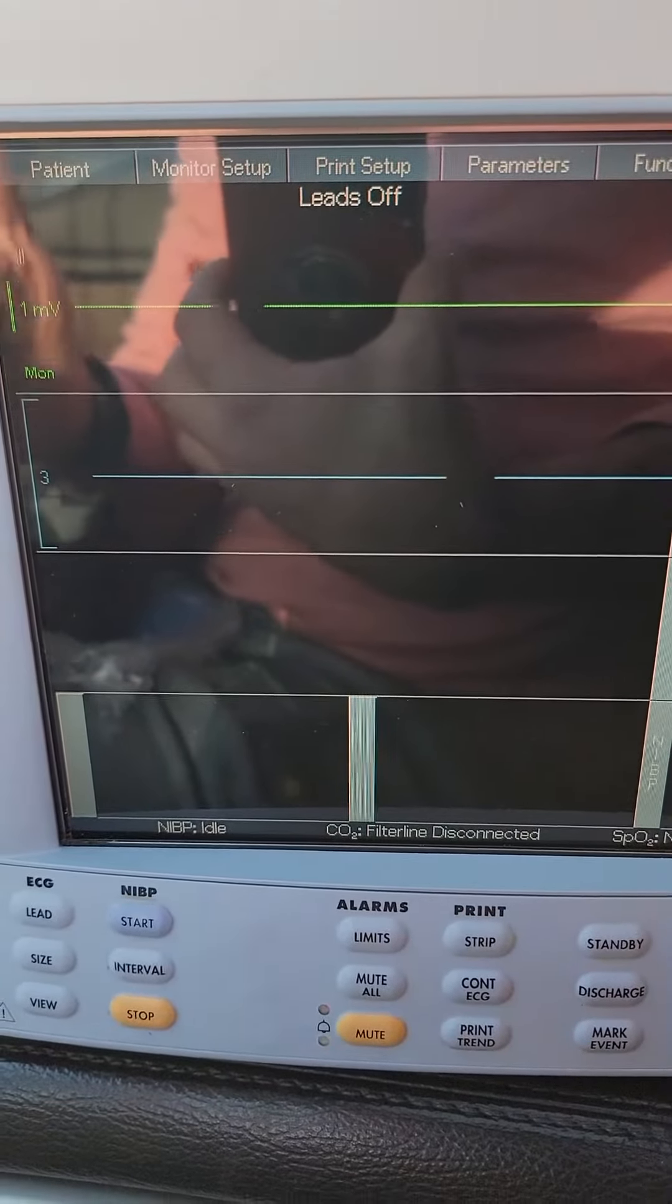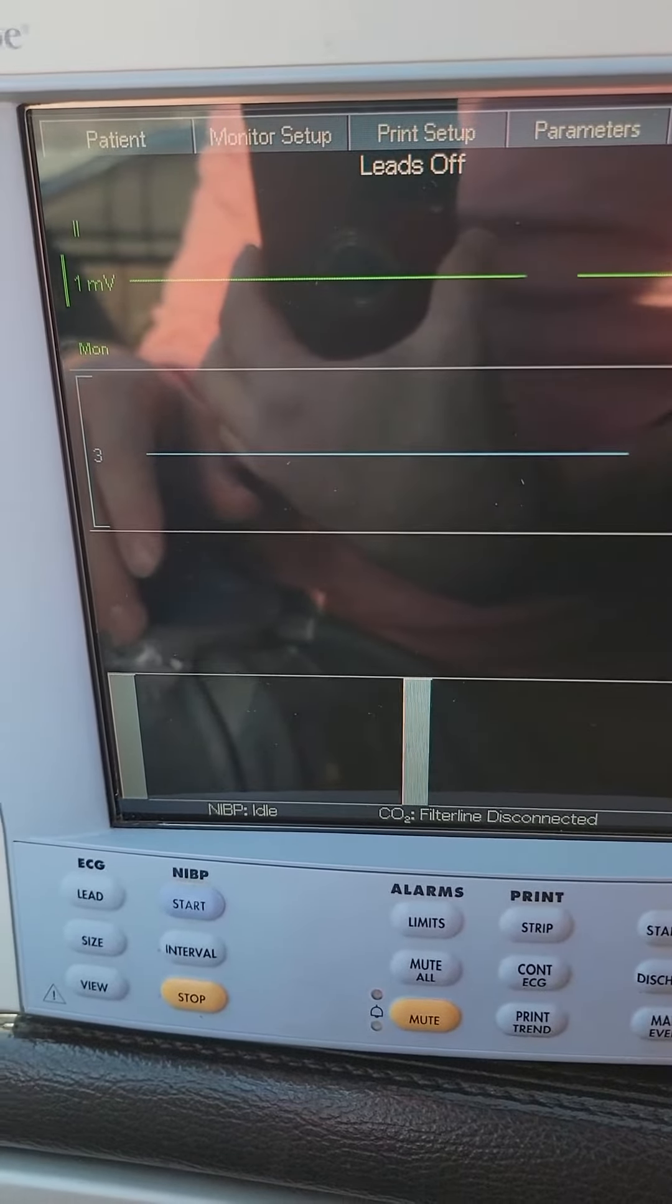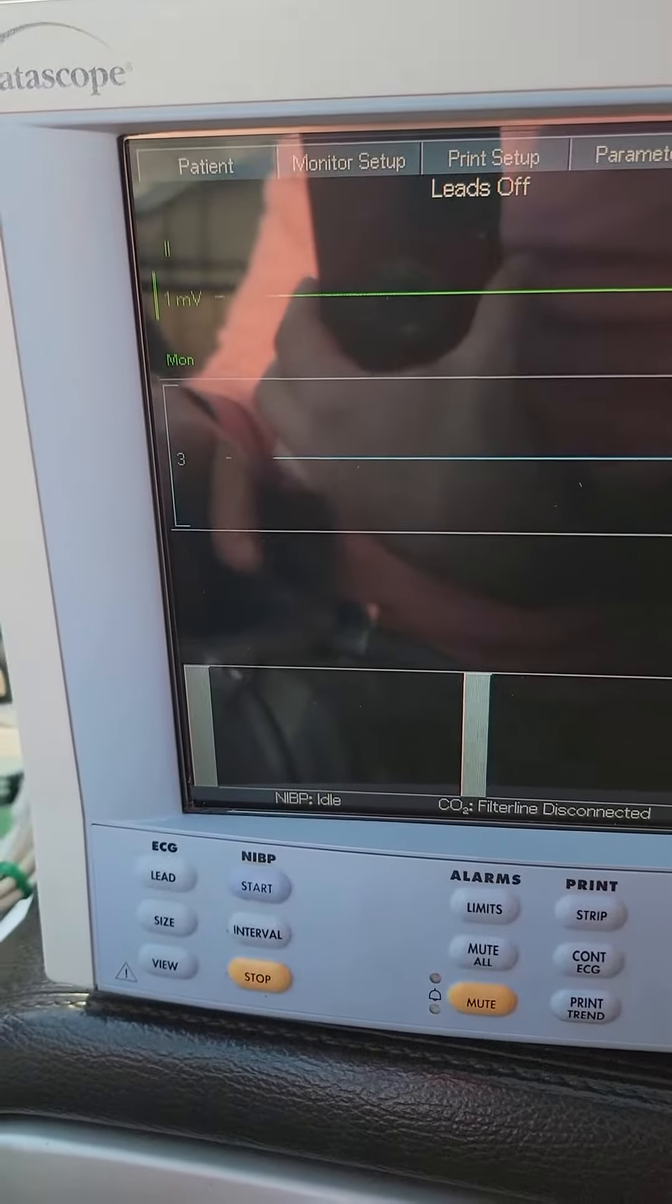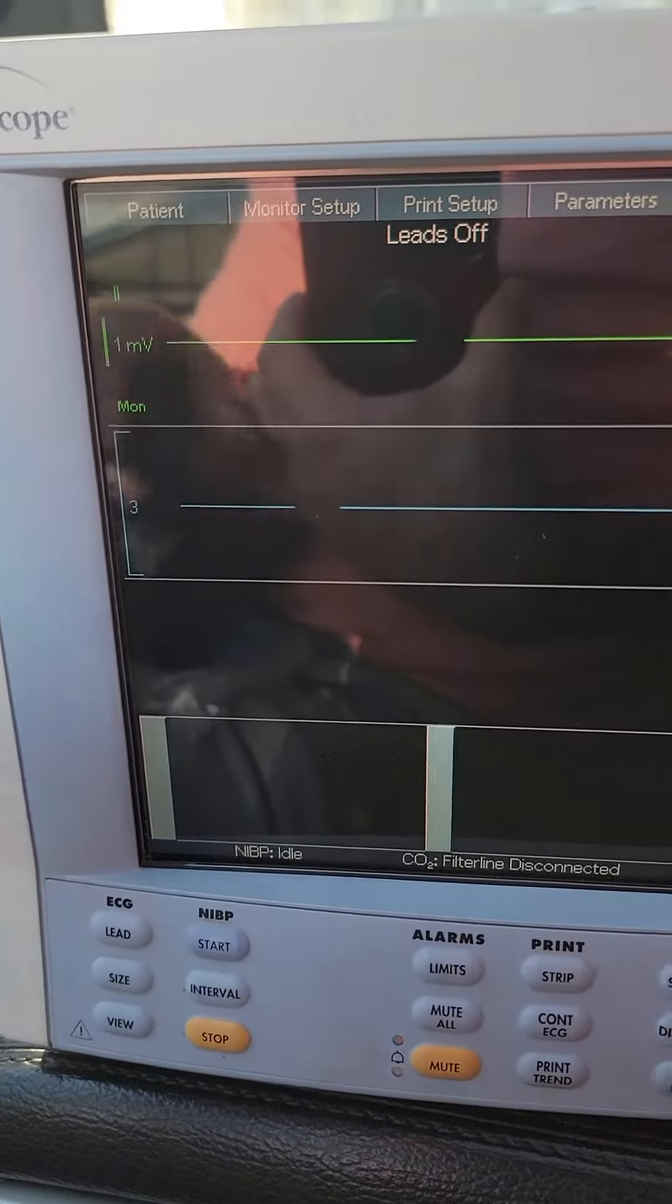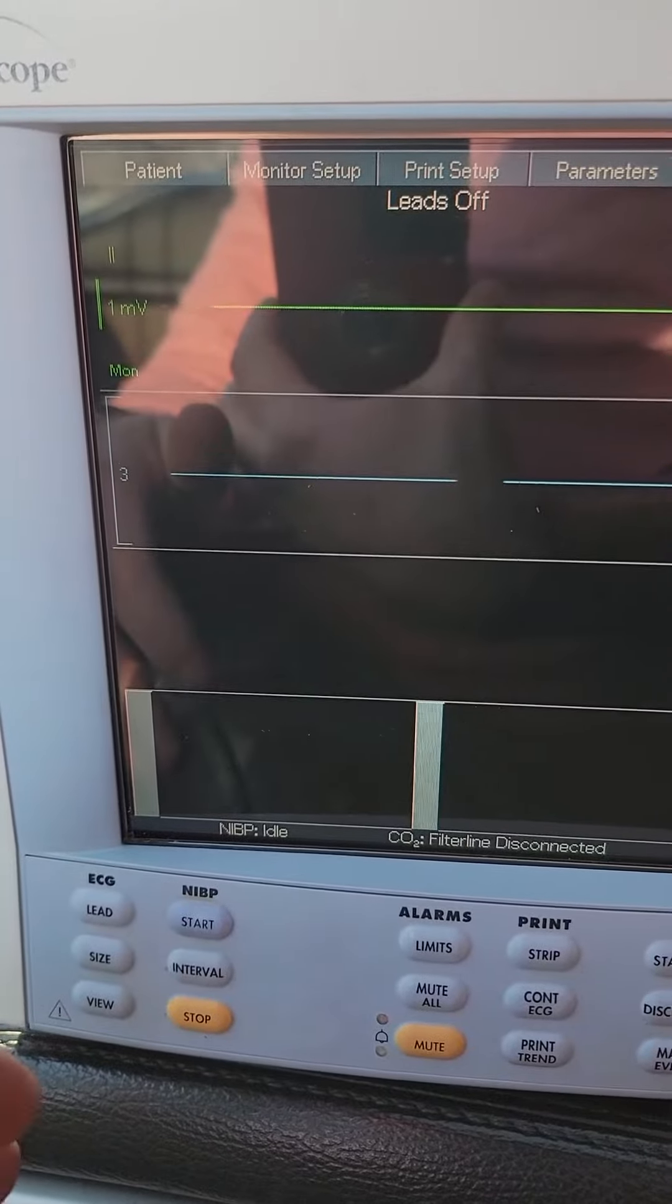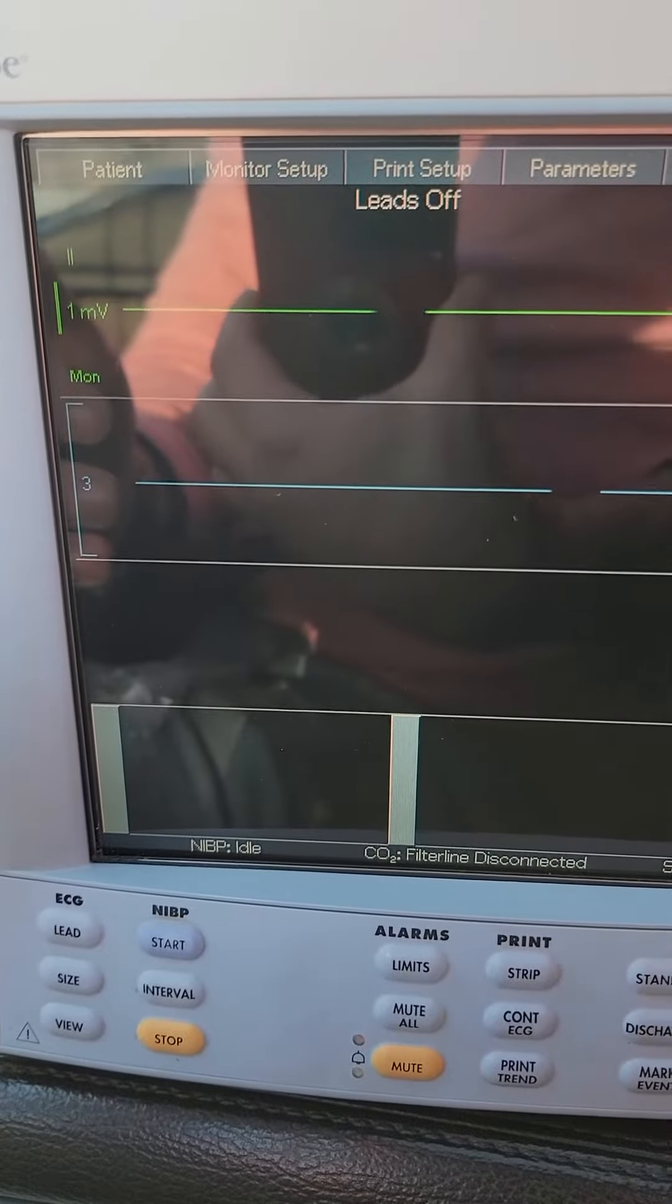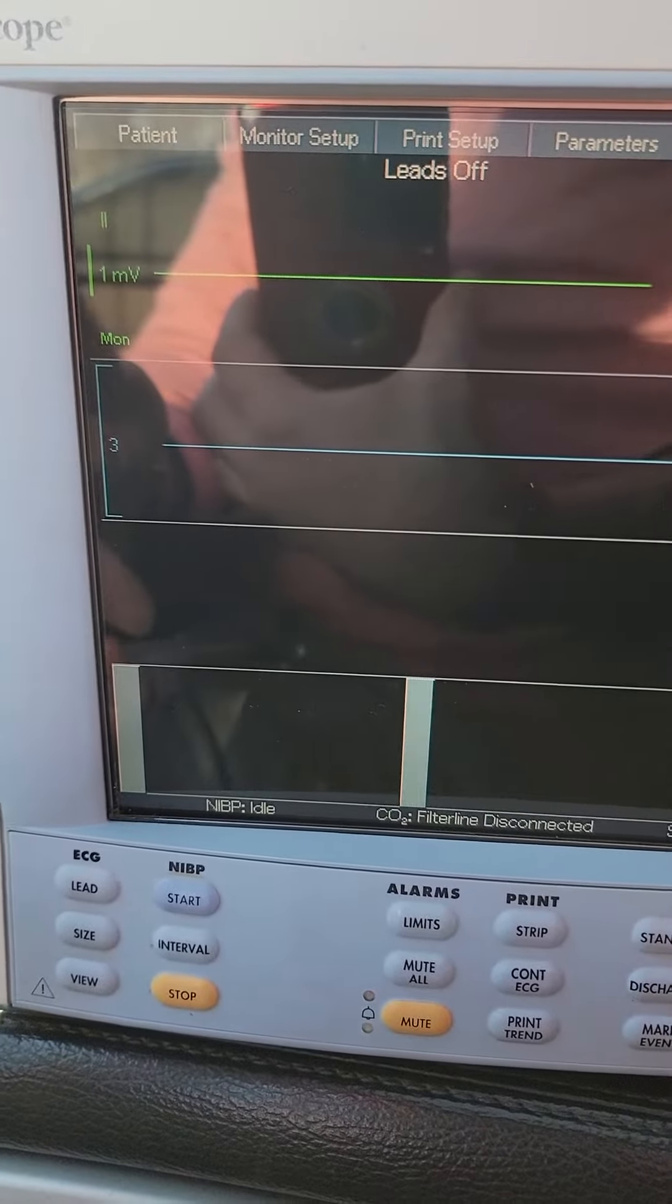This one we're seeing a lot. You get ECG, you get no waveform, nothing coming through, and very frequently lately, what I'm seeing is that these monitors are set for auto-detect.